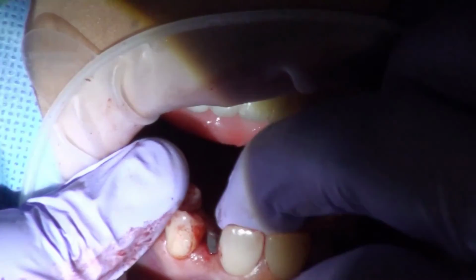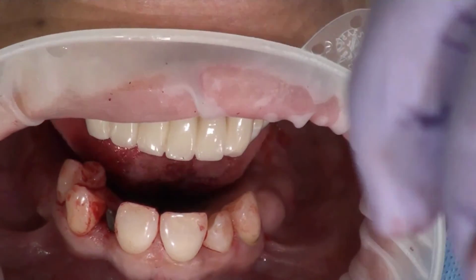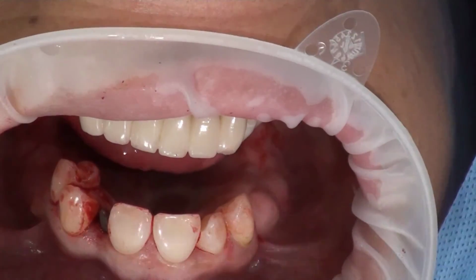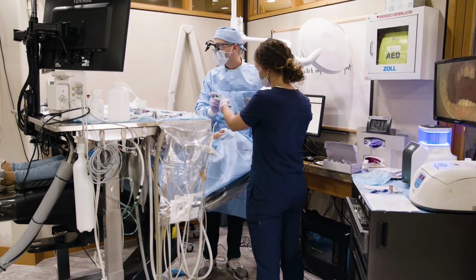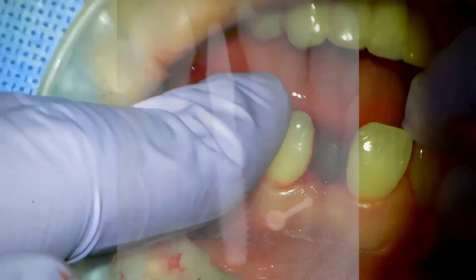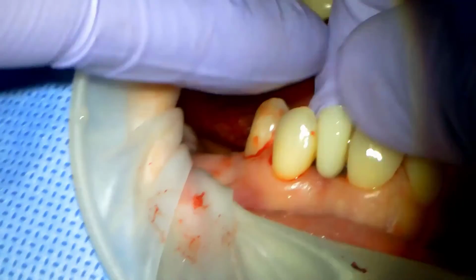So now it looks like the abutment is seated properly. Let's go ahead and take one more x-ray to confirm. Put it up there. Real big. So there's the abutment in place. I'm going to go ahead and try our crown in now. Okay, real big.